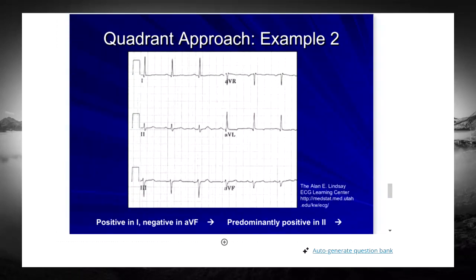Yeah, they're going to have that. But even if not, it should always have those, because you have to know that they did this right. Another thing will happen, I should tell you all this. Again, that's why it's important to know that you have a standardized ECG. There are some ECGs that will come out straight.